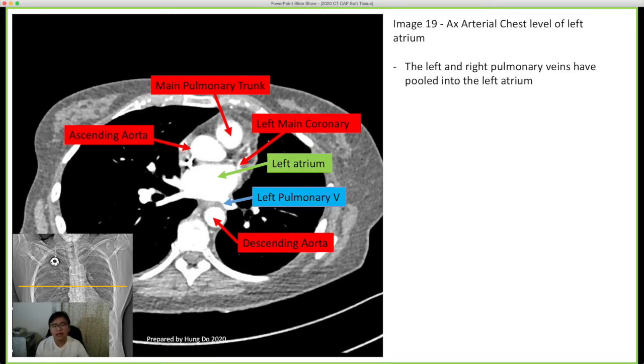The reason is if you inject into a port that is not CT compatible, we often do CTs with a power injection device. That device has a very strong output. And if the port isn't designed for that strong output, there is a chance that you might damage the inside of the port, or even worse, you might damage one of the fragile lines inside the port.